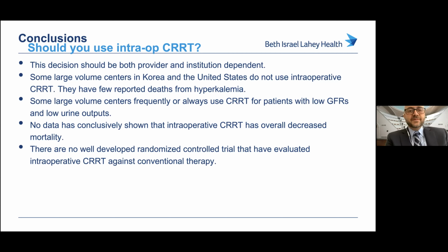Excellent. Another question that came in, what is your preferred cannulation site for the CVVH? So we prefer the right IJ for a dialysis catheter. We've done them in the groin before. We try not to do a subclavian for such a large line like that. Also, if they did end up needing long-term dialysis, placing a subclavian in them may have some issues for the vascular surgeons later on. So the best place we like to do it is in the right IJ, but we do it in other places. We place it in the left IJ, and we place it in the groin if we have to.